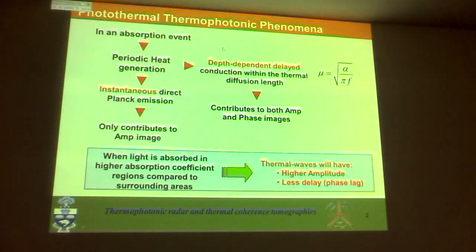Well, photoacoustics is a propagating field. The wave equation that you have is second order in time, which means you can have a propagating pulse. The pulse goes forward, it goes back, and so on. You have a time delay. Heat conduction is different. Heat conduction is a diffusion field, and it is very different to the optical diffusion that Boas presented yesterday, though both of them have similarities. Once I have diffusion, then I have lossy waves, I have loss in energy, and I propagate in waves that I cannot turn back and have a recurrence of the original operation. That is, I cannot reverse time.